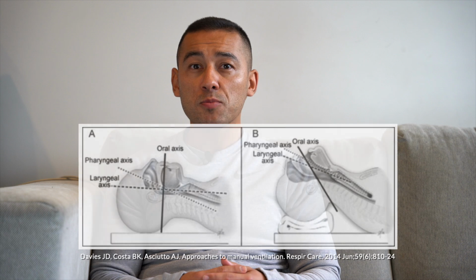If possible, the patient should also be placed into an inclined position in order to improve laryngeal view and first-pass success. Furthermore, when it comes to optimizing patient physiology, evidence suggests that an incline of at least 30 degrees improves functional residual capacity from 2.1 liters to 2.91 liters.